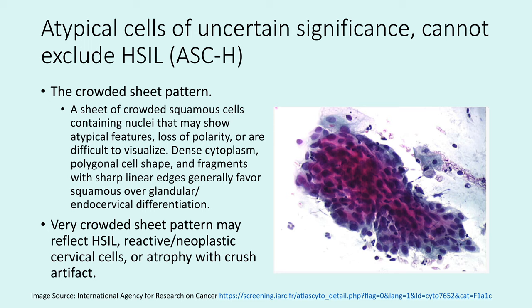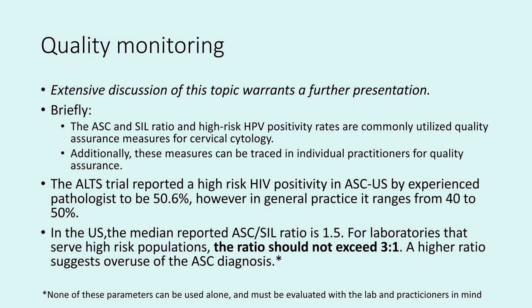The crowded sheet pattern can represent many things — glandular, reactive, or squamous. In the ASC-H category, you would see a sheet of crowded squamous cells with nuclei showing atypical features including loss of polarity, dense cytoplasm, polygonal cell shapes, and fragments with sharp linear edges suggesting squamous rather than glandular origin. A very crowded sheet pattern can reflect high-grade, reactive changes, or atrophy with crush artifact. When examining hyperchromatic crowded groups, look carefully at the edges and focus up and down — on exams, the edges usually provide clues to the cell origin and the intended diagnosis.